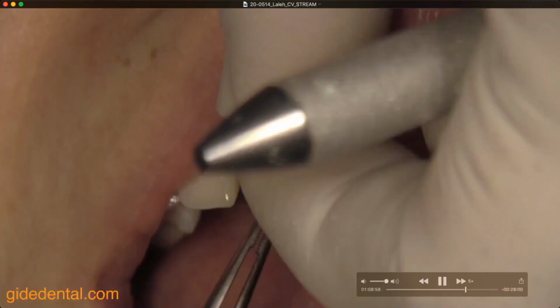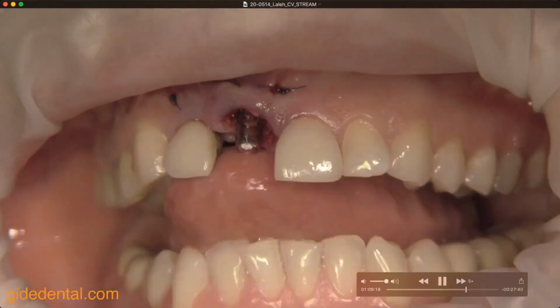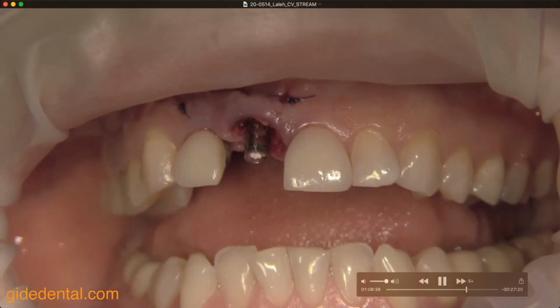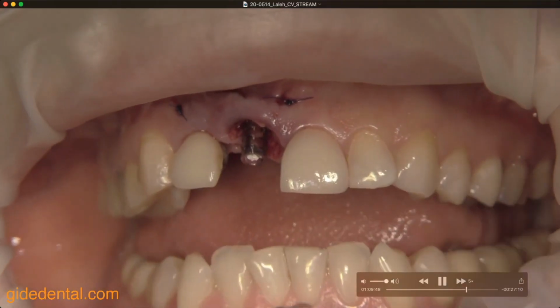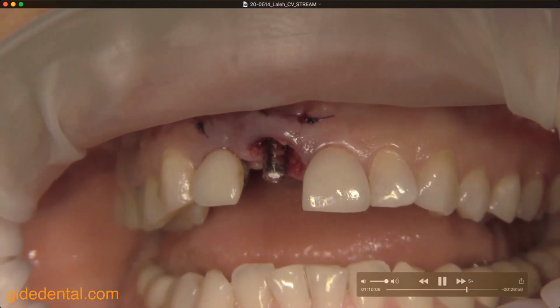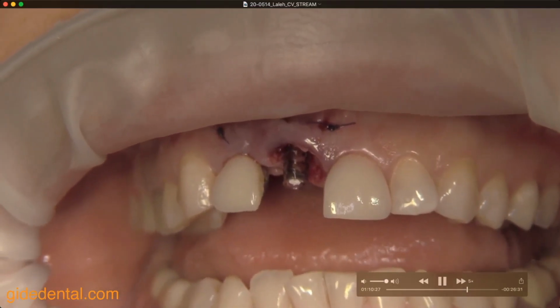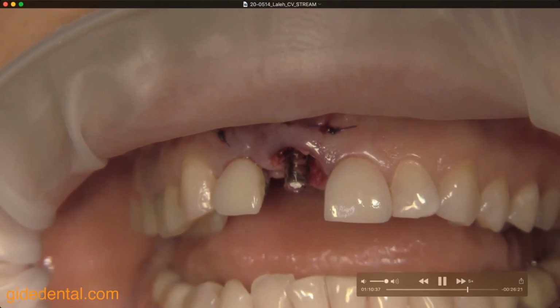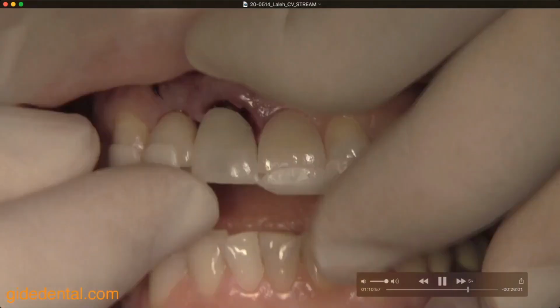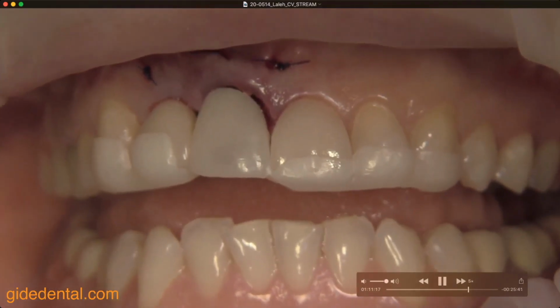Filling the temporary titanium abutment, and now we're going to be ready to fill the space of the temporary with an acrylic or composite, and to basically do a pickup. So you can see that, just a final check.